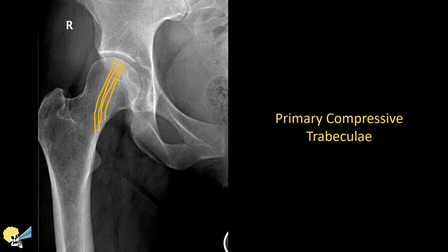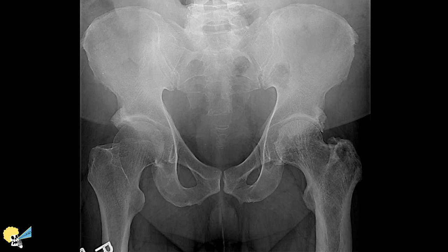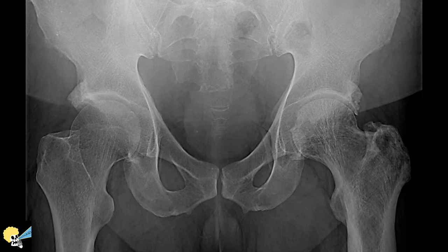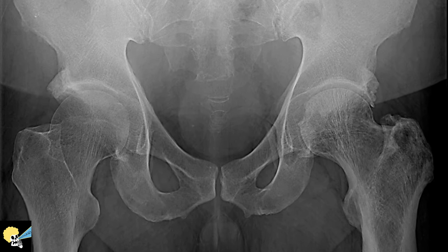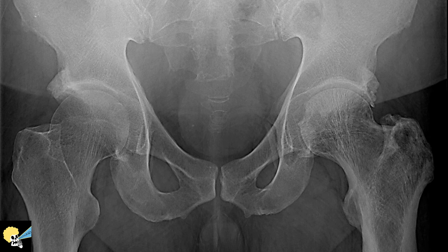Now, let's evaluate this pelvic radiogram. Do you see any trabecular abnormality? If you look closely at the region of the femoral heads and necks, you can probably notice that the left femoral neck trabecula is more prominent than the right.